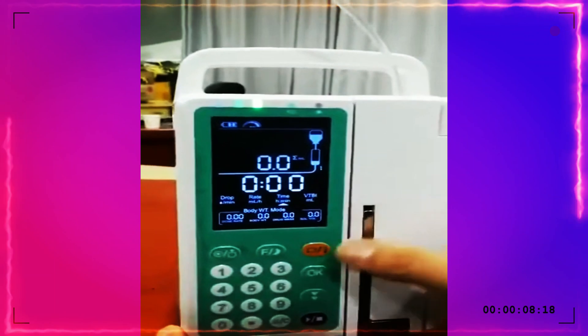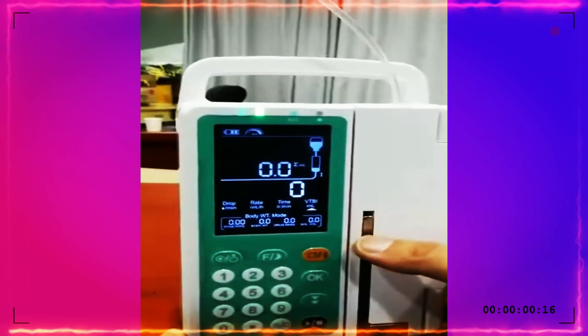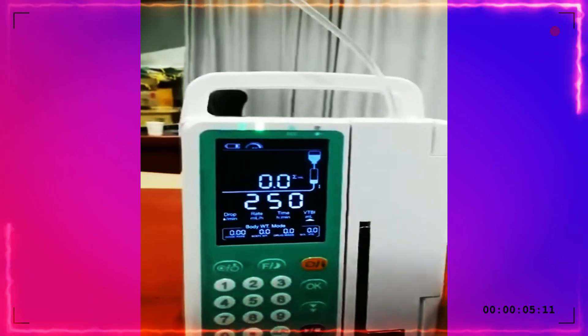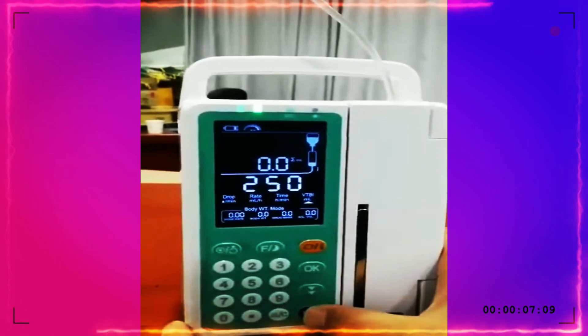For example, the VTBI — the volume of the drug we want to infuse — set to 250. Then press start.